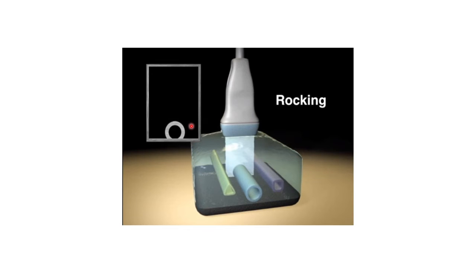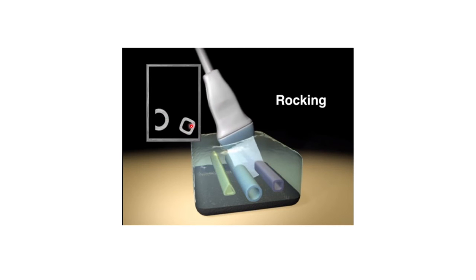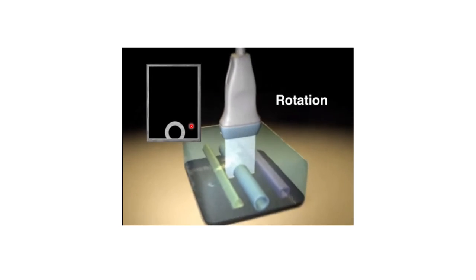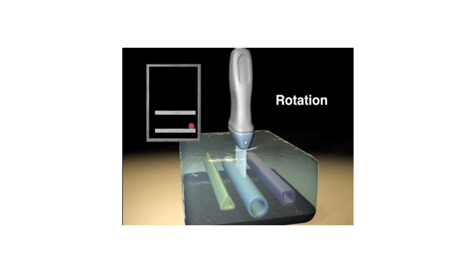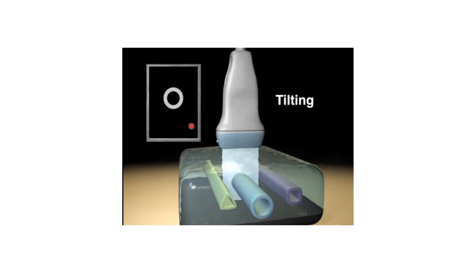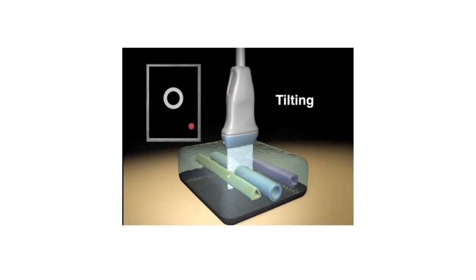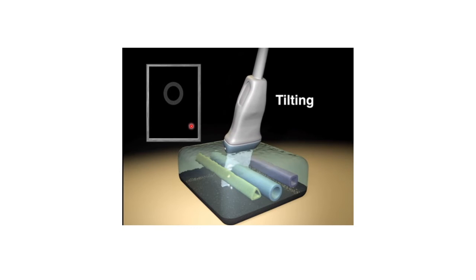The other is rocking. That is how we do rocking, and rotation, and tilting. Tilting is otherwise called fanning. That is, you angulate, otherwise called angulating or fanning or tilting.